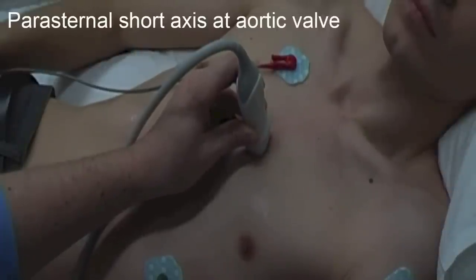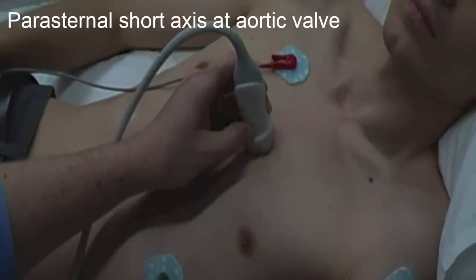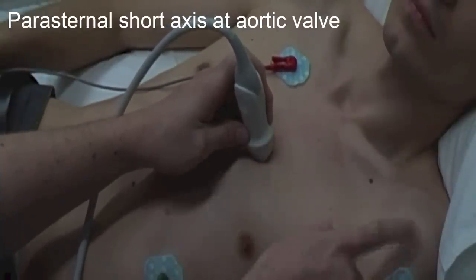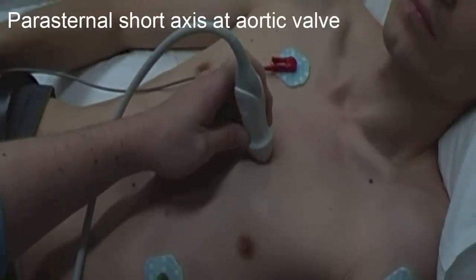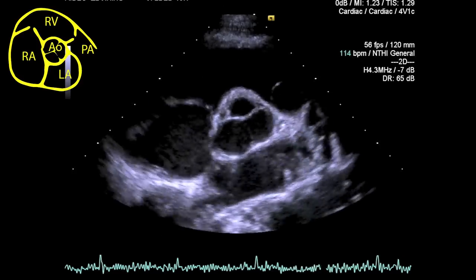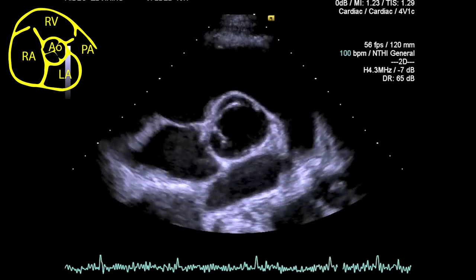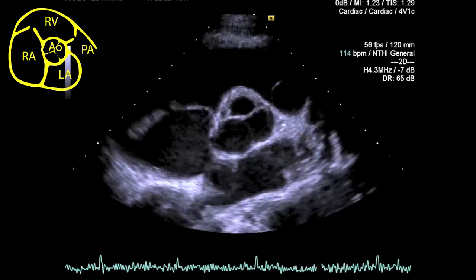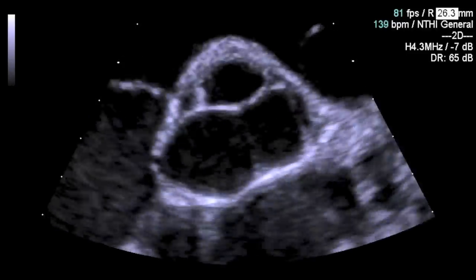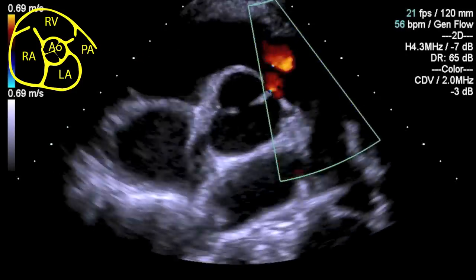The next view is a parasternal short axis at the level of the aortic valve. From the long axis, rotate the probe clockwise through 90 degrees with the probe marker pointing towards the patient's left shoulder. You should first see the aortic valve on short axis — look for the Mercedes-Benz sign in a tricuspid aortic valve. You'll also see the right ventricular inflow and outflow wrapping around the aortic valve. Zoom in and apply colour flow Doppler to all valves to look for any gross valvular regurgitation.